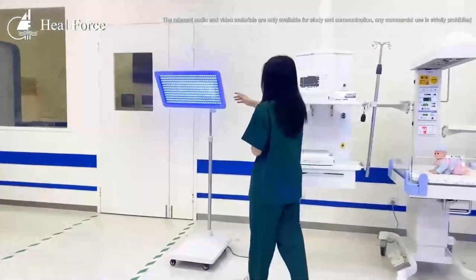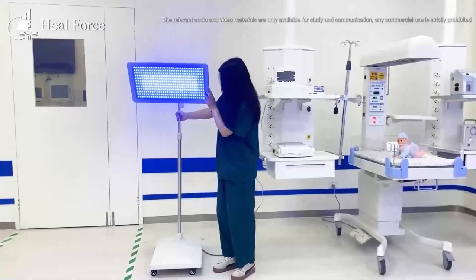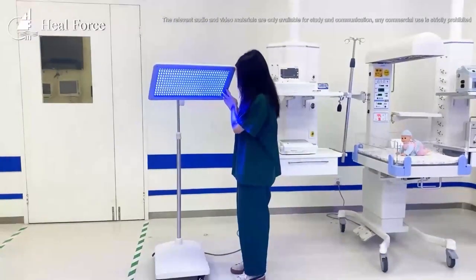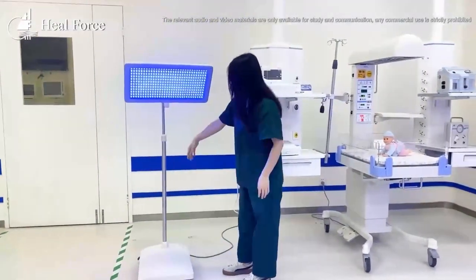We have multiple models. This is our floor-type model. You can move the machine easily in different directions, from place to place. The height is also adjustable.